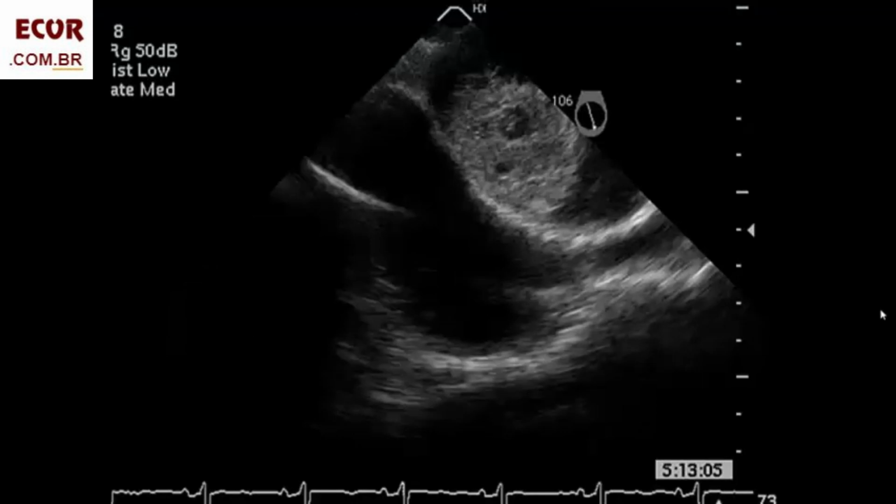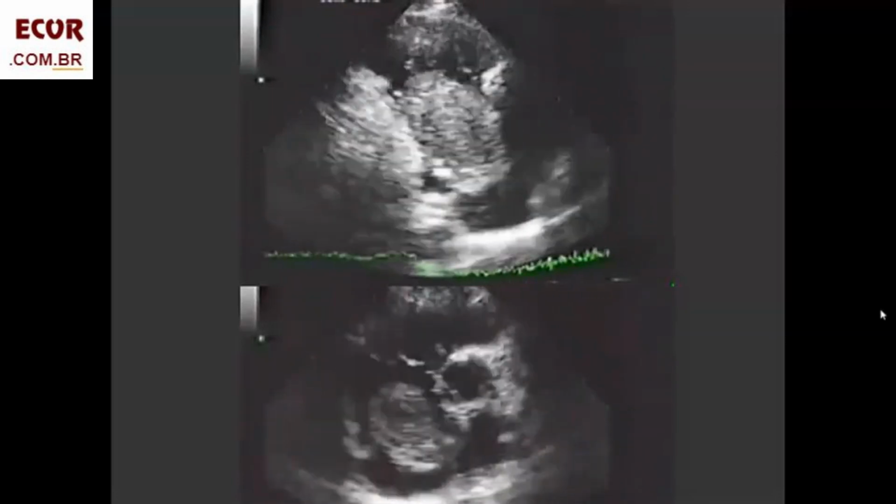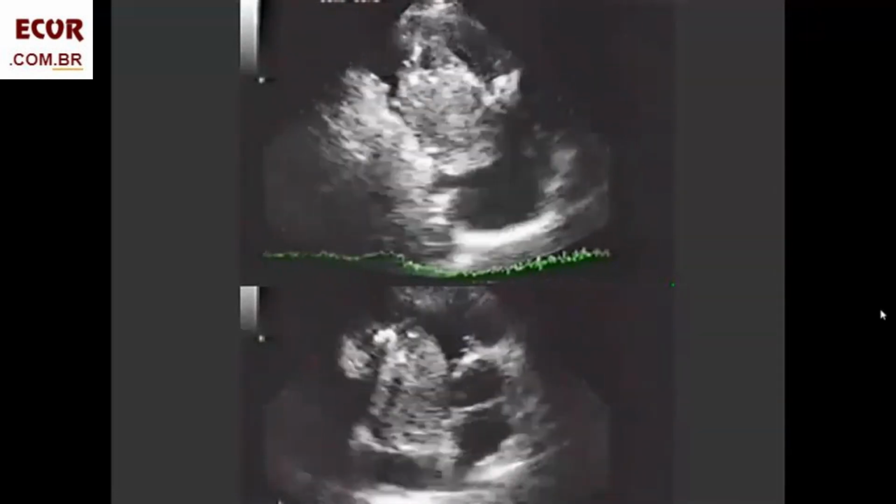Look at this one. These less echogenic areas may indicate a fast-growing mass when the blood vessels are left behind and create areas of necrosis, and may be more frequent in malignancies. However, it's not a good sign for malignancy, since it's also common in non-malignant tumors due to local hemorrhage, not distinguishable from necrosis. Here we see a right atrial myxoma, the second most frequent location of this kind of tumor.